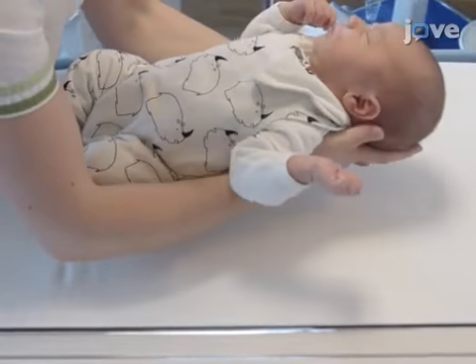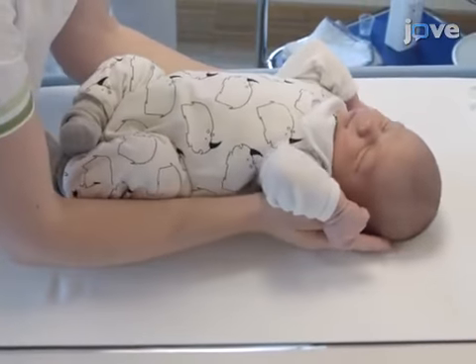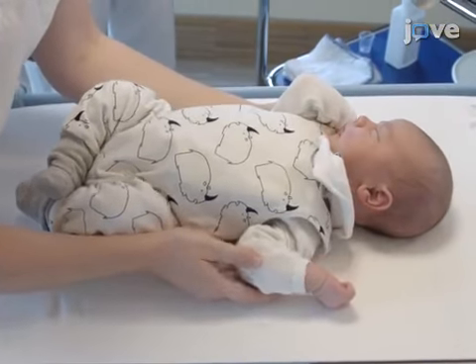Before starting, ensure the baby is quiet and settled. The baby can be asleep, but sucking motion should be absent during the recording because of movement artifacts.